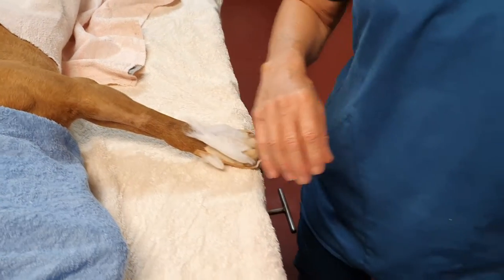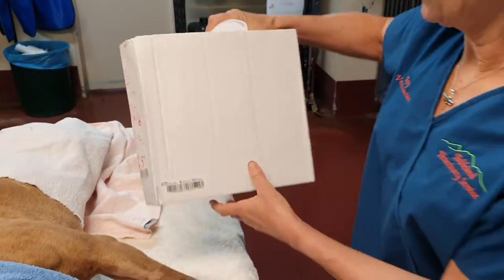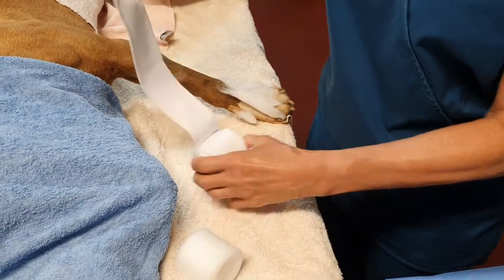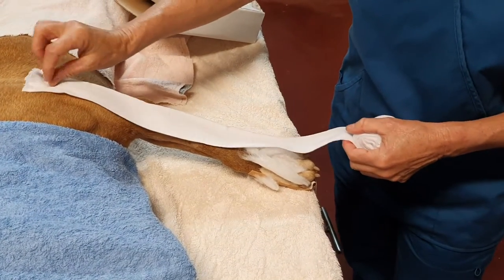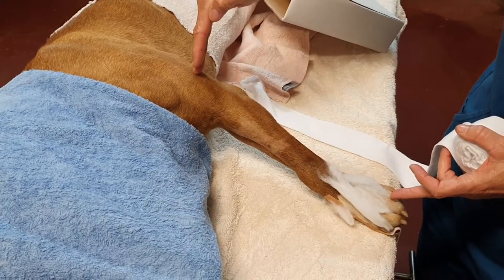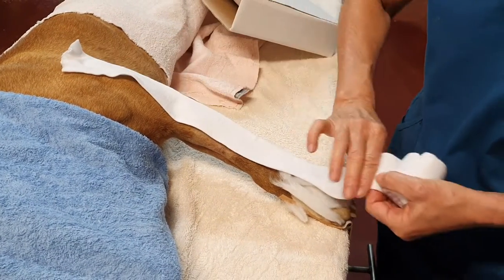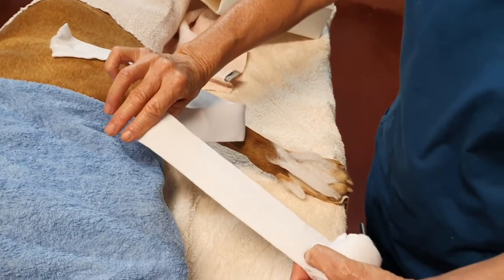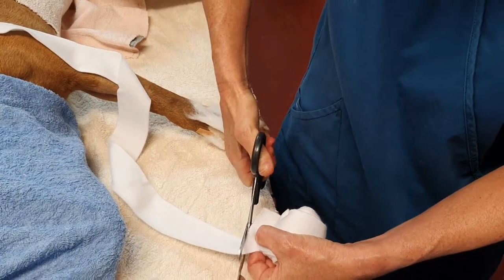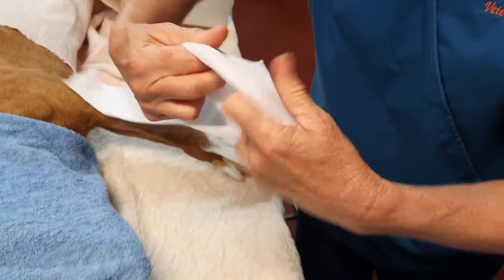Next we will come over and get our stockinette — tubing. This comes in different diameters. It's a nice thin tubular gauze material and makes for a nice underneath layer of a splint. So I'm measuring — I'm going to be putting a splint that goes from above the elbow to the end of the feet. So I measure past the upper level, past the distal level, then I give myself a little bit more — possibly another third again — so I've got plenty of length. When we stretch this bandage it'll go wide and shorten. Let's cut that off and then just roll it together like so.